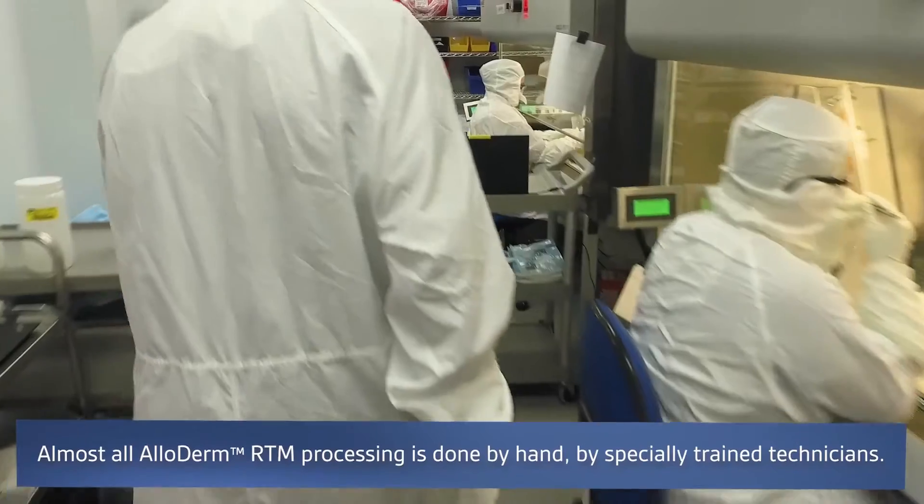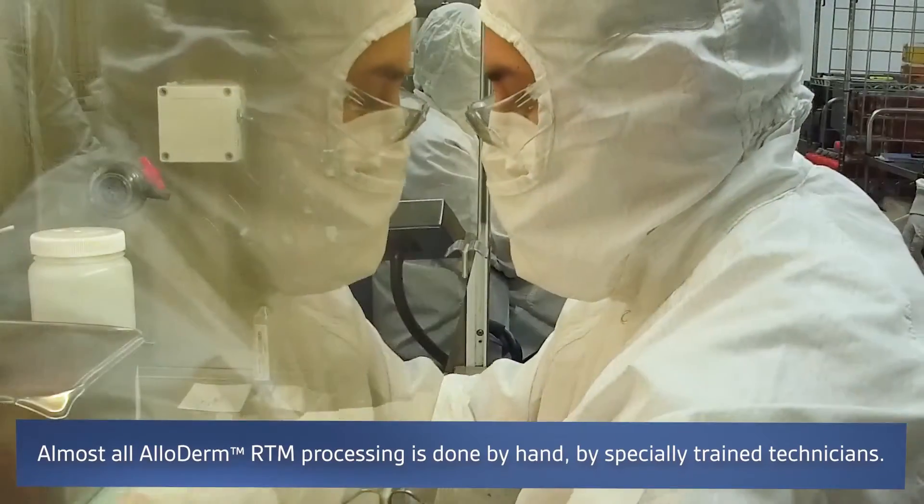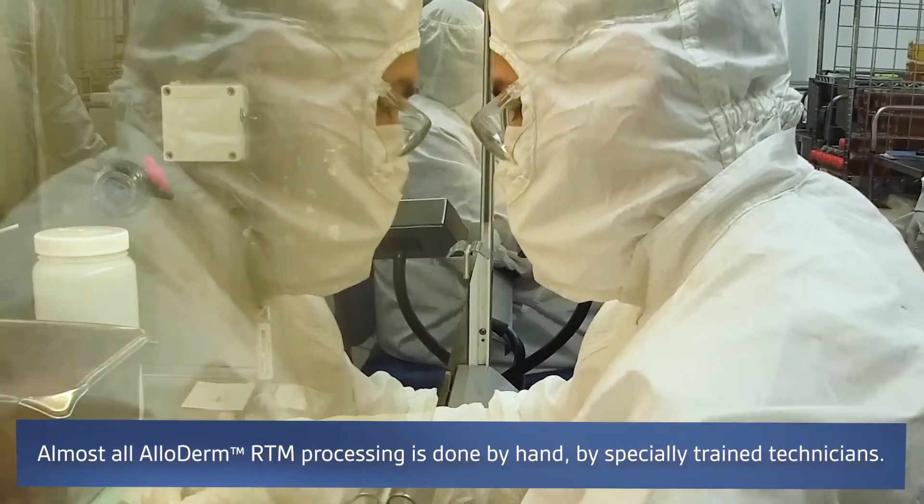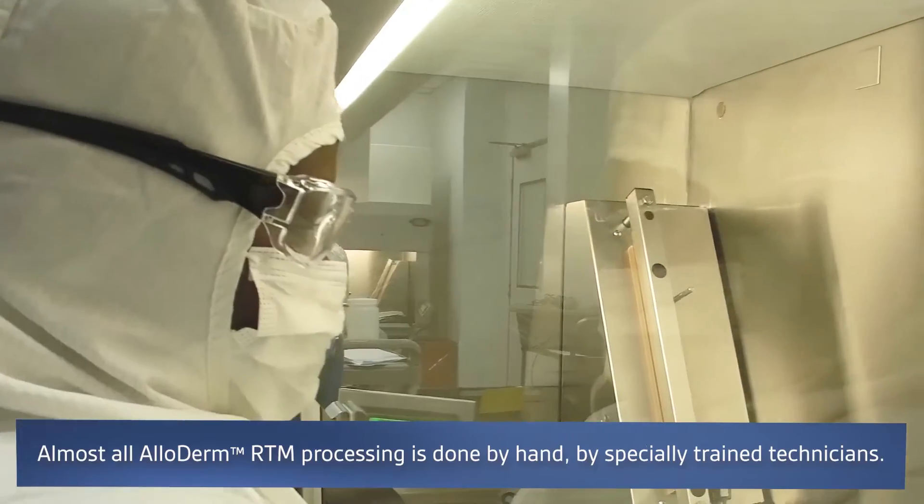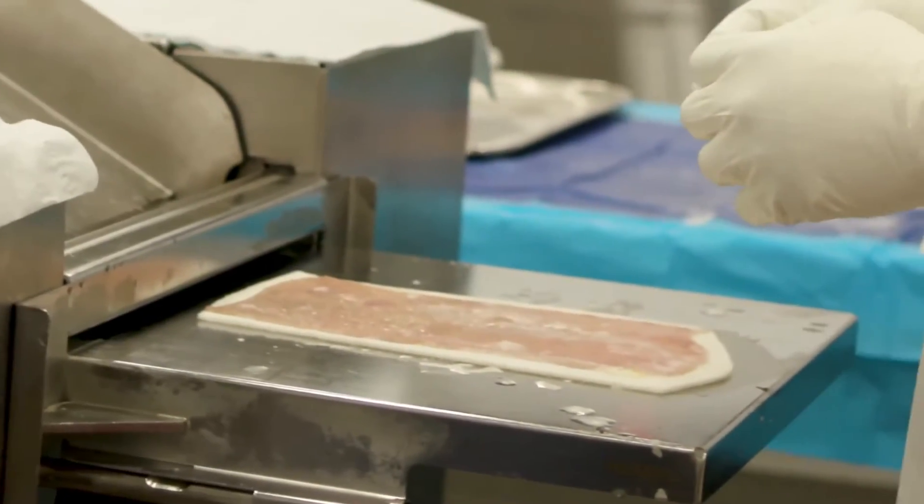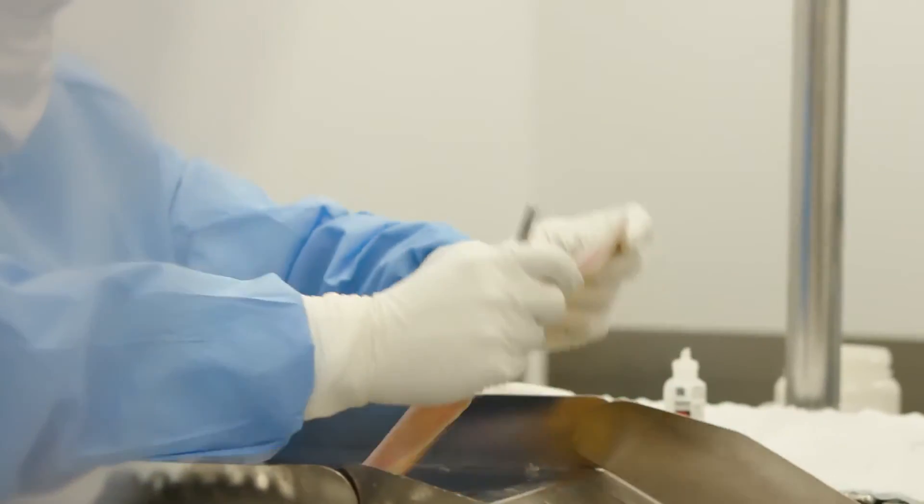The first step is to manually defat the tissue to prepare it for further processing. The dermis is then evaluated for defects such as moles, which are carefully cut out to maximize usable tissue. Different tissue thicknesses are created—Alloderm is available in five different thicknesses.